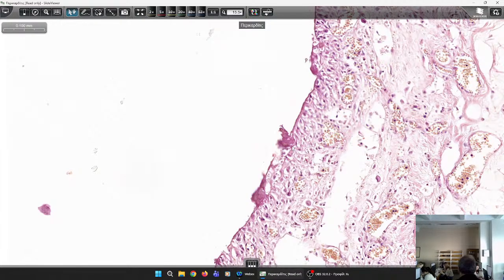It's similar to what happens in other cavities in the human body lined by mesothelial cells, the pleura and the peritoneum. Inflammation there, when organized, since the inflammatory exudate is rich in fibrin, may form strictures. And we have obstruction of the bowel, constrictive pericarditis here, or pleuritis, the pleuritic pain in the pleura.